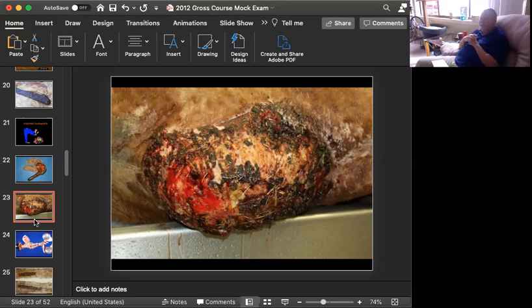It's an interesting lesion because if you look at those little hotspots, you will see the outlines of these hyphal-like structures with Pythium, or actual fungal hyphae with Zygomyces. They don't stain well on an H&E, so you see them in negative relief against the inflammation. If you put a silver stain on it, they'll pop up real well. The reason I take either Pythium or Zygomyces, or in a dog or a cat, I would take Lagenidium, is that I've been burned because they all look exactly alike on H&E and silver stains. You can't tell the difference. So you really need to go for culture, which is a long process, or preferably PCR to identify the culprit in this one.